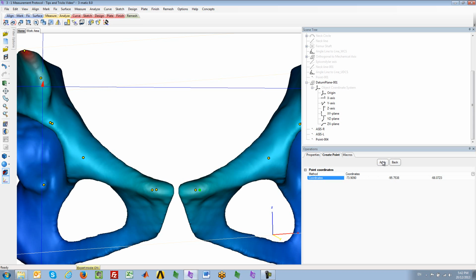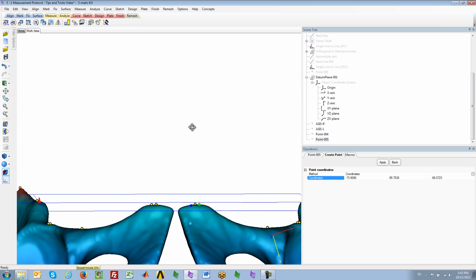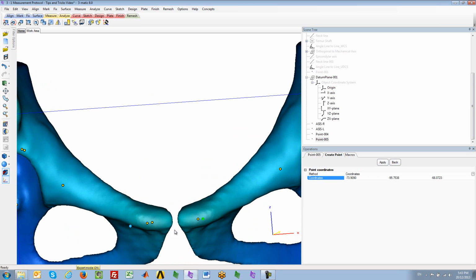If the extrema analysis is showing 2 points close to each other, that's because they have the same extreme, so they're the same distance on that platform, and that's why it's representing 2.